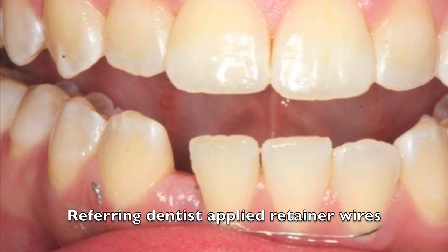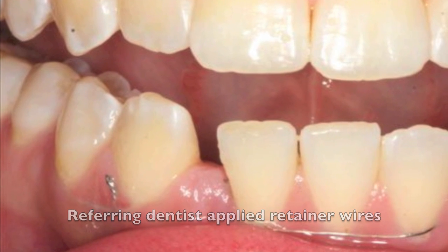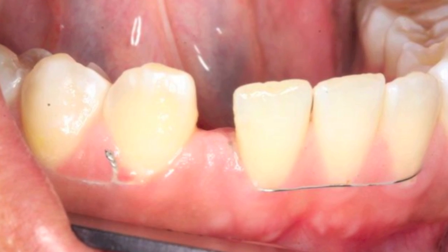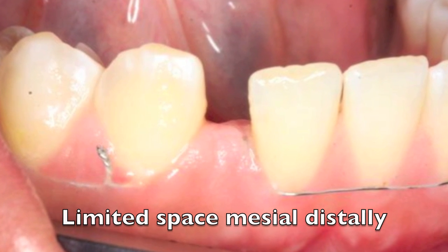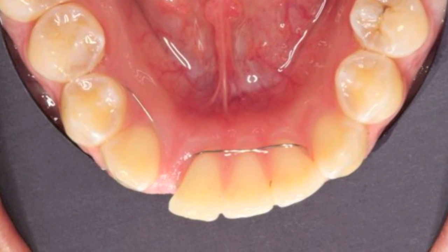Hello, this is Dr. Scott McClain. Today's case is going to demonstrate how to replace the lower missing lateral. You can see here the space is very limited from a mesial-distal standpoint — it's too narrow for an implant right now.